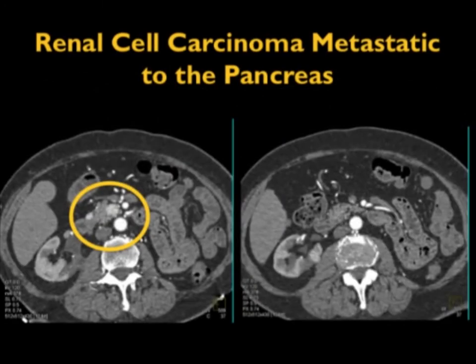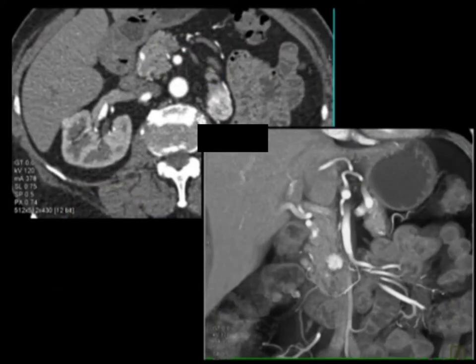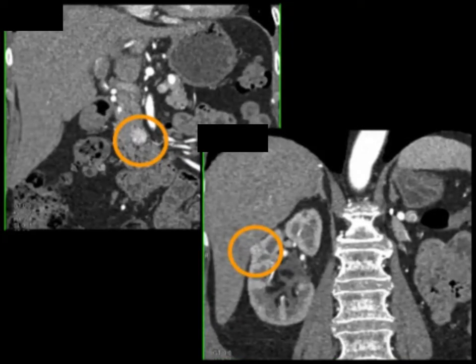Another example. Look at this case. The patient has several lesions seen in the head of the pancreas in this patient with renal cell carcinoma, left nephrectomy. And yes, you could think about a neuroendocrine tumor, but they're usually not multiple, but the missing kidney gives it away. There's the lesion, very nicely seen. And oh yes, by the way, there's a 1 centimeter or less lesion in the right kidney, which is a secondary site of renal cell carcinoma. Again, pancreas Mets and secondary site renal cell carcinoma.